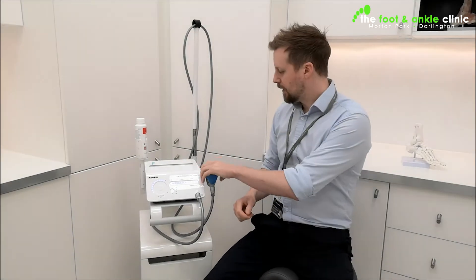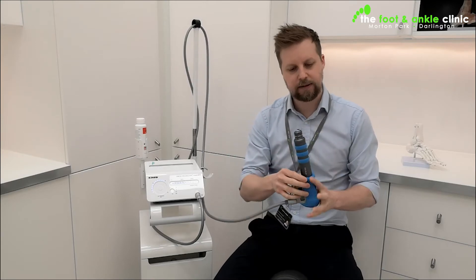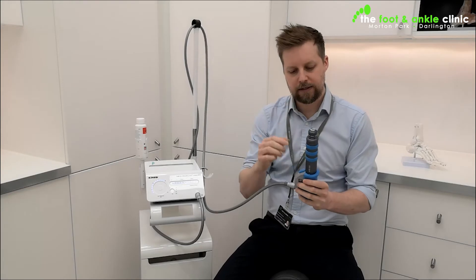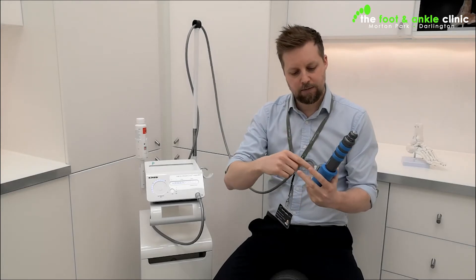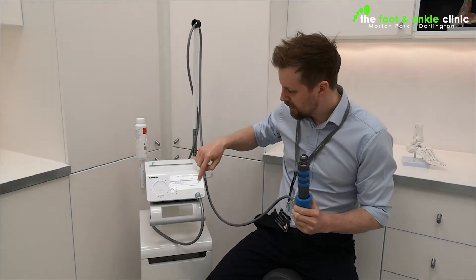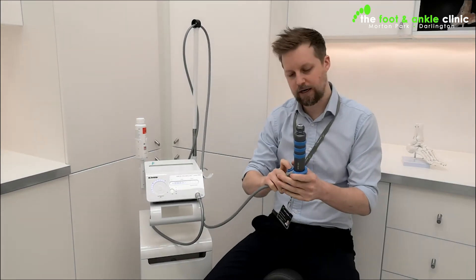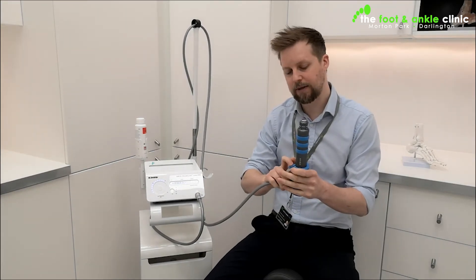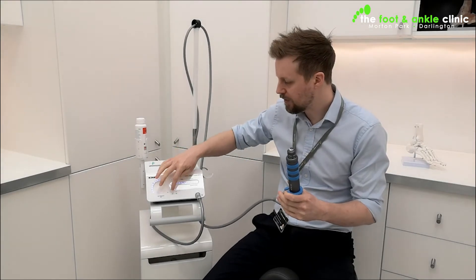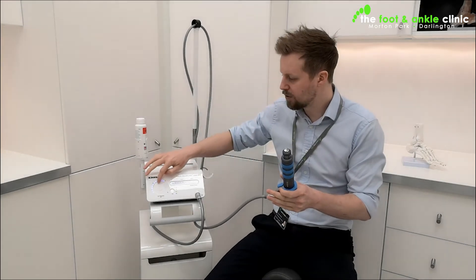What it does: this little piece of kit here has a ball bearing inside it. This is applied to the skin, just like that. When the machine is turned on, the ball bearing fires up and down at a different rate. Those rates are altered here and can be set at something very low — low moving but actually quite high impact, which sounds just like that. Or it can range right the way down to something much more like this.